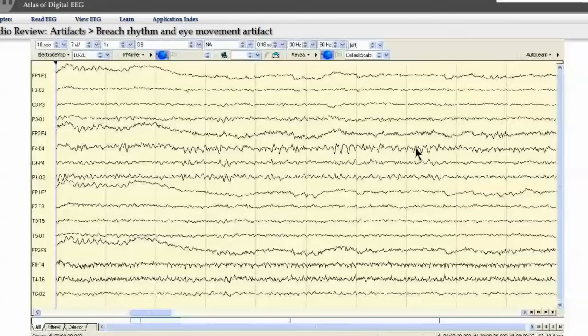Here, in fact, there's a mixture of both, with a notch at the top of each alpha frequency or fast theta frequency. There's no disturbance in the baseline, and therefore this does not represent slowing or some focal cerebral problem. These arcuate shapes, without a spike-slow wave morphology, do not represent epileptiform morphologies and therefore not epileptiform discharges.